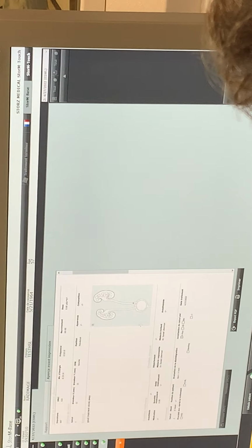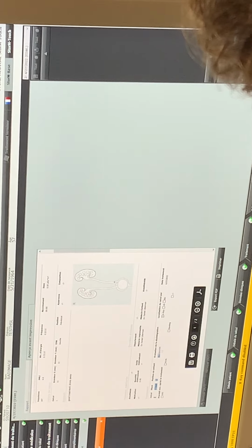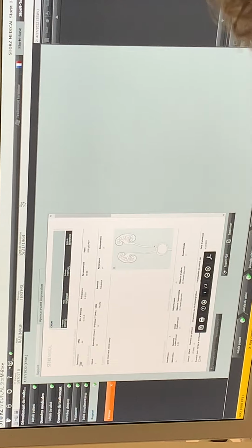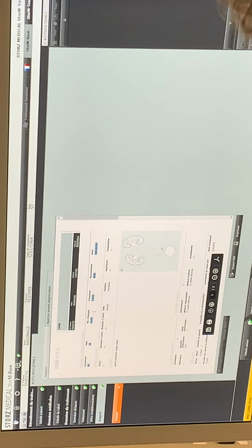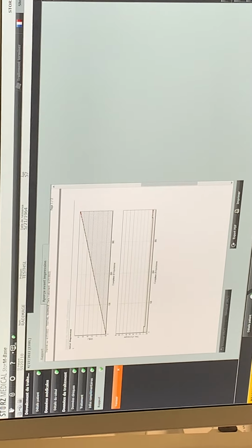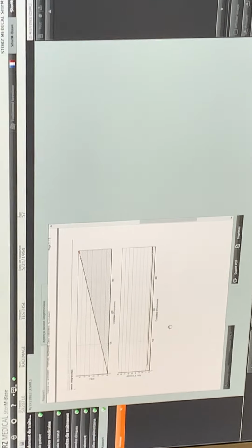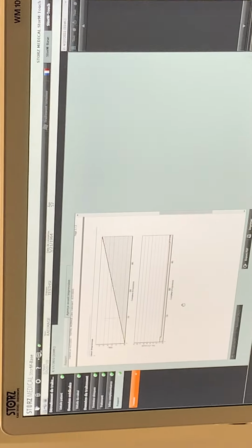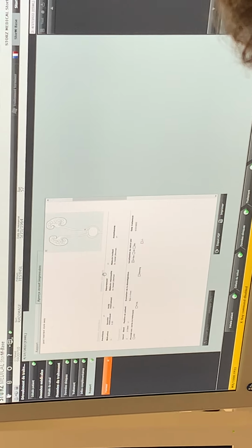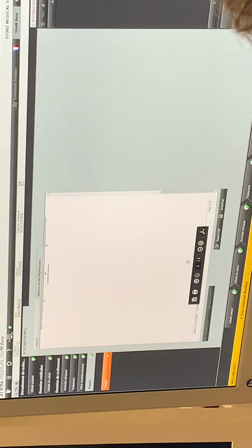So now you see your report here inside. You see as well what you did with the stamp, with the localization, the treatment. You see as well all of your information about the shockwave. You see the SMLI, how much energy you applied to the patient, and how many pulses you did at which energy level. And that's where you see the minimum and maximum frequency and all of these things. And normally the next pages would be X-ray images.